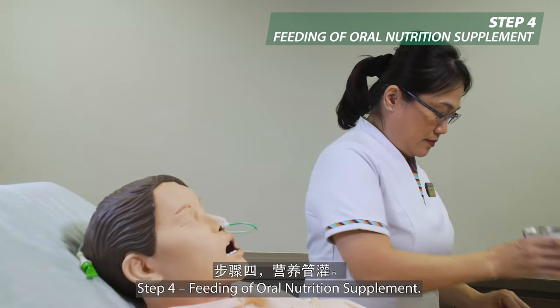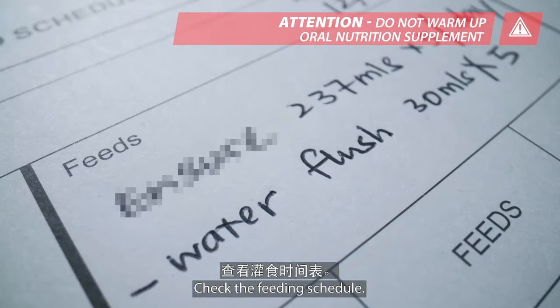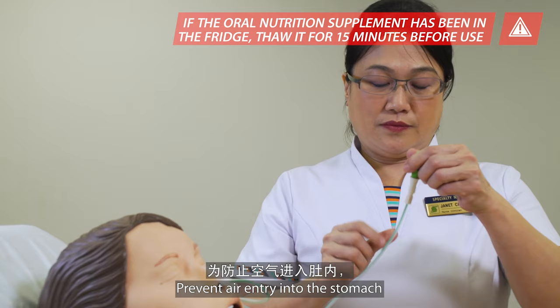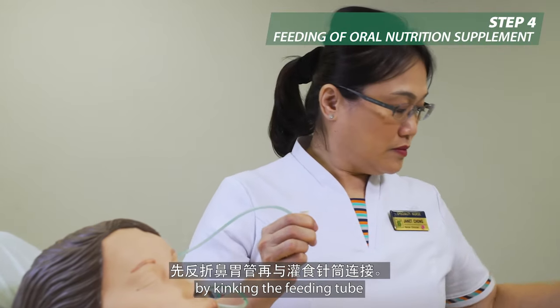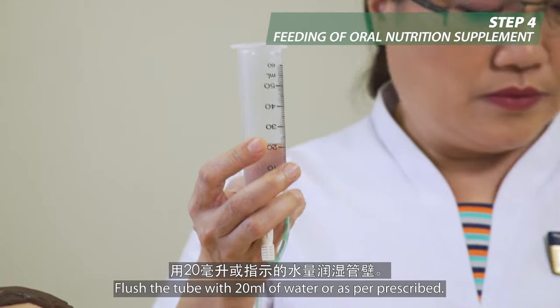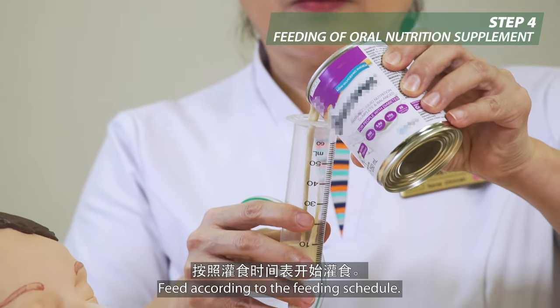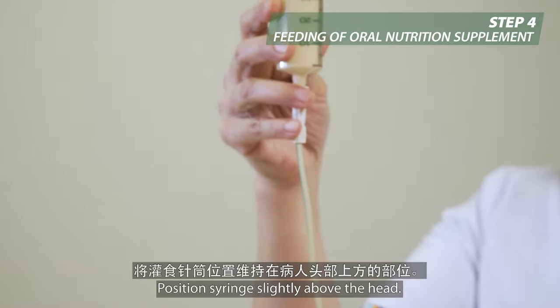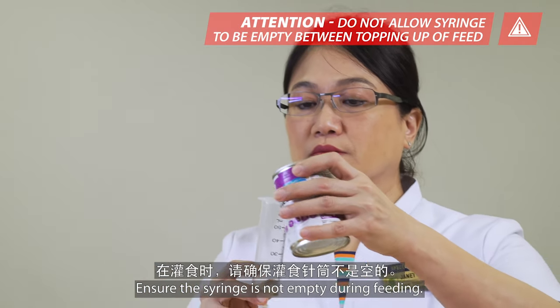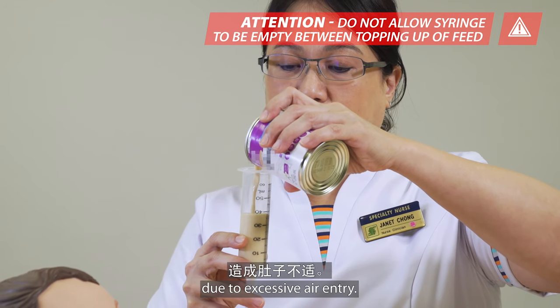Step 4: Feeding of oral nutrition supplement. Check the feeding schedule and prepare the correct amount and oral nutrition supplement prescribed. Prevent air entry into the stomach by kinking the feeding tube before connecting the syringe. Flush the tube with 20 ml of water or as per prescribed. Feed according to the feeding schedule, positioning the syringe slightly above the head. Ensure the syringe is not empty during feeding, to minimize stomach discomfort due to excessive air entry.